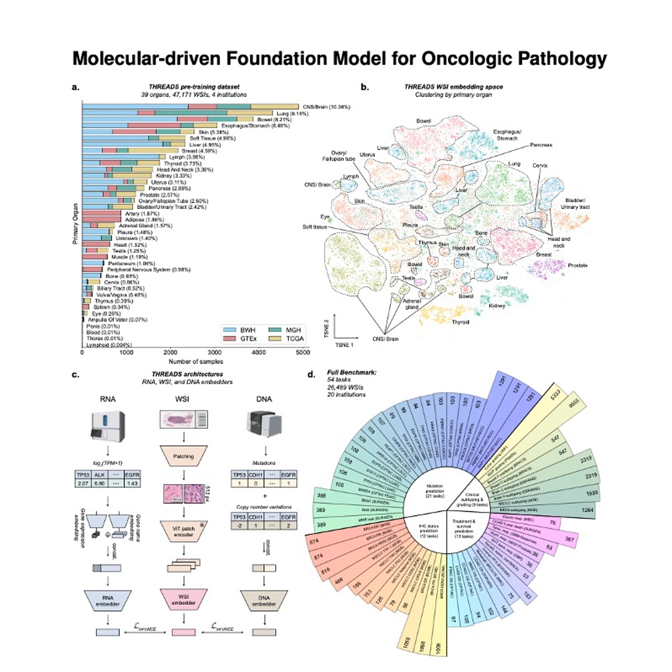That's exactly it. That efficiency is successful transfer learning. For instance, on common tasks like identifying invasive ductal carcinoma in breast cancer, Threads, with just linear probing, hit 98.3% accuracy. Which is competitive with models specifically built and fine-tuned just for that one task. Yeah, competitive with much larger specialist models, but achieved with minimal extra effort because the foundation was so strong.